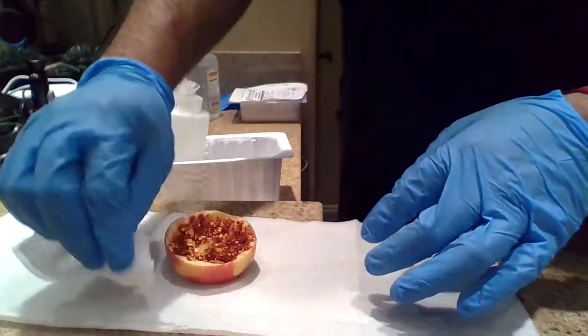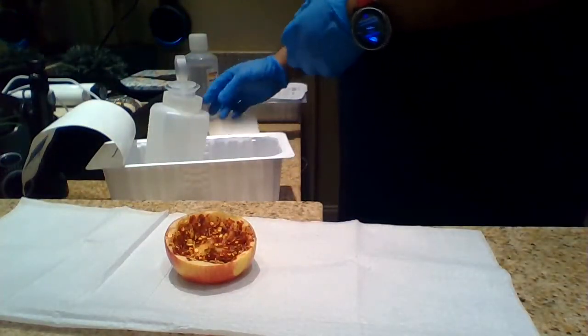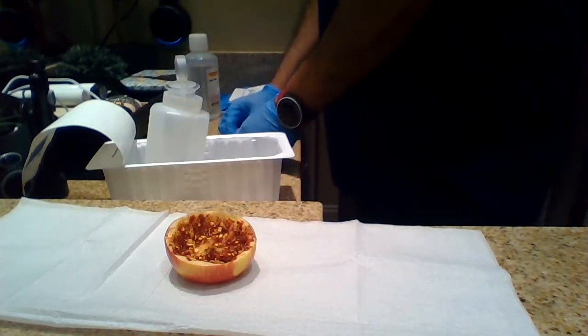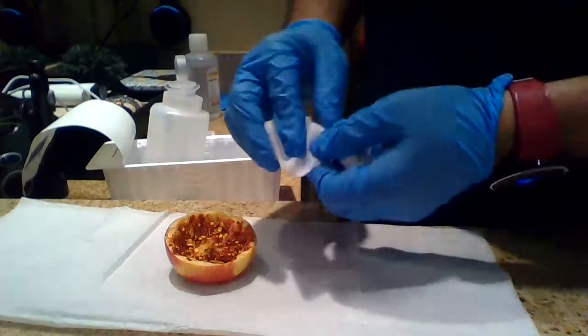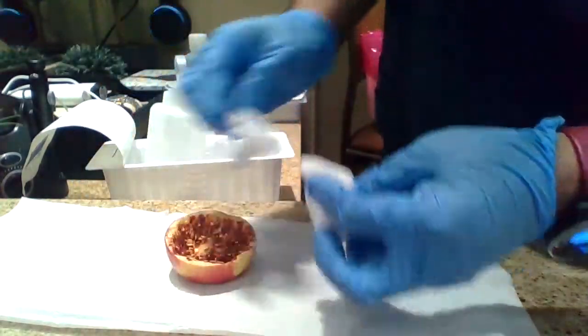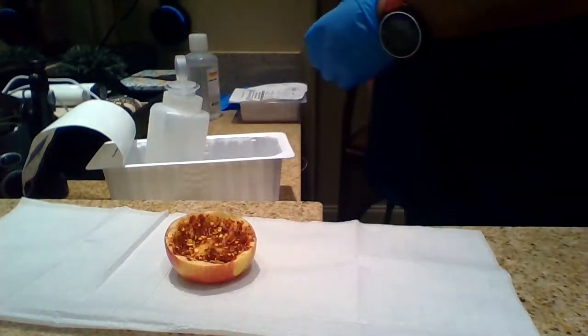So we'll clean around, we'll clean on the inside. Again, when you irrigate, you only irrigate in one direction until it runs clean. So there, we're irrigating, we're running it, we're patting it dry, we're cleaning it. So again, dump it whenever you're done.